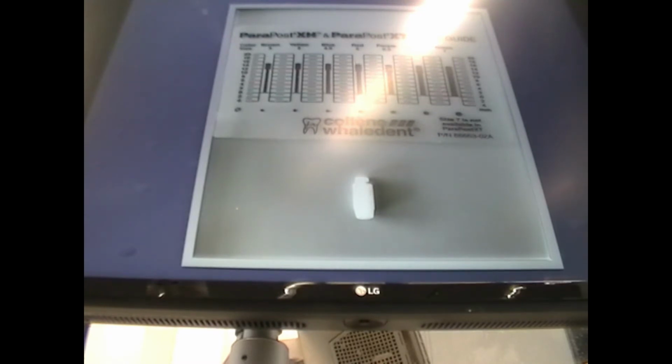Okay, parapost size guide. It's gauged in millimeters. The color guide, brown is the most narrow. Yellow, blue, red, purple, black, green. Okay, maybe used green twice in my life. Maxillary canine maybe, where I was doing a post and core, and again brown would be maybe a little mandibular incisor, something with a very small narrow canal.